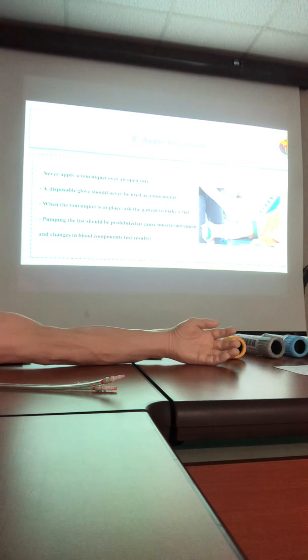Okay, and pumping the fist should be prohibited. You should ask the patient to make a fist, just a fist, never pumping the fist. Why? It can cause muscle movement and change in some of the blood components, especially the lactic acid inside the muscles. When the patient moves the hand, the lactic acid goes to the bloodstream, and the level of lactic acid will be falsely elevated.